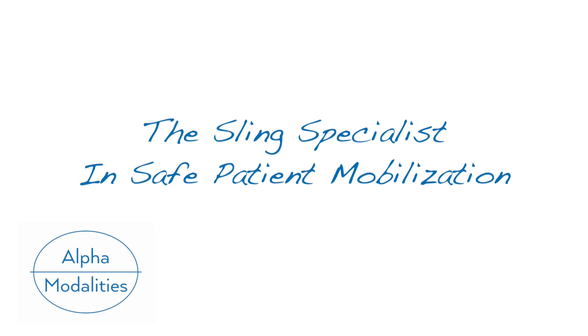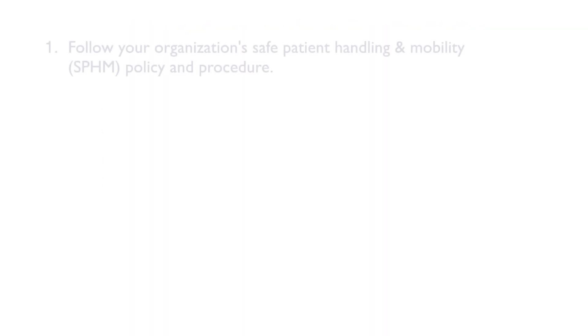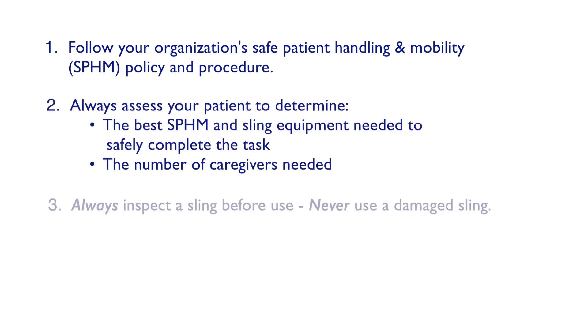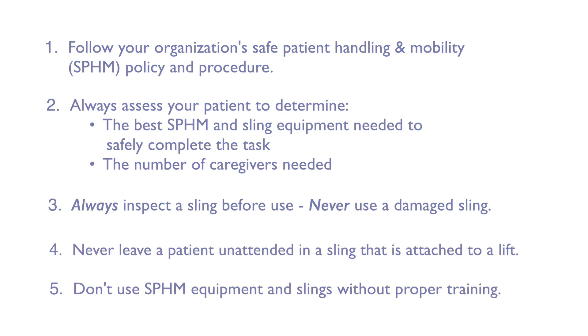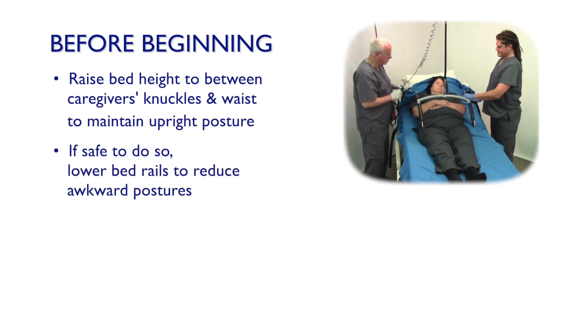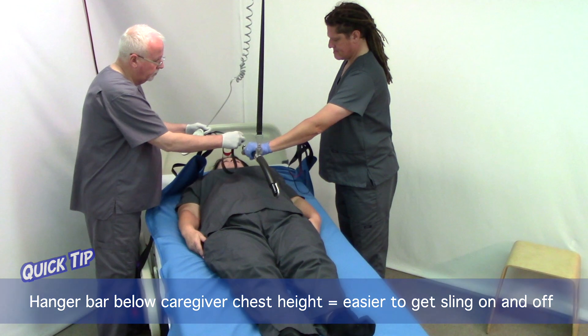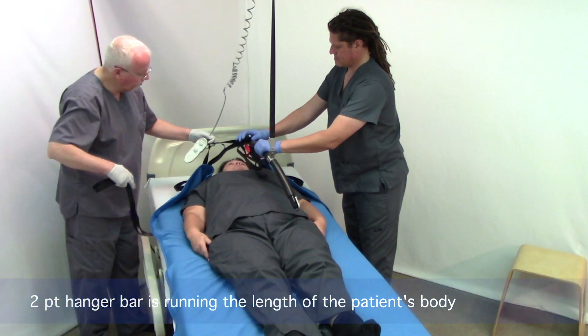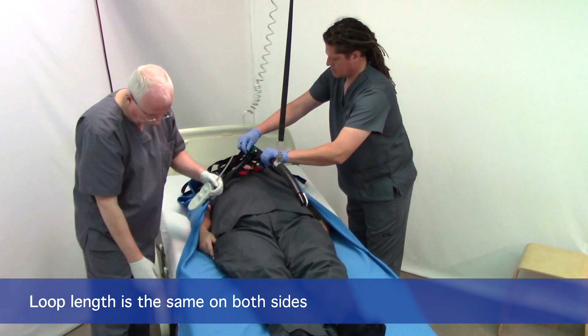Thank you. So we're going to boost our patient with a two-point hanger bar and the TSL turning sling. We're going to start at the head of the patient and choose the same length straps on both sides — or loops — so short or medium, working together as a team.